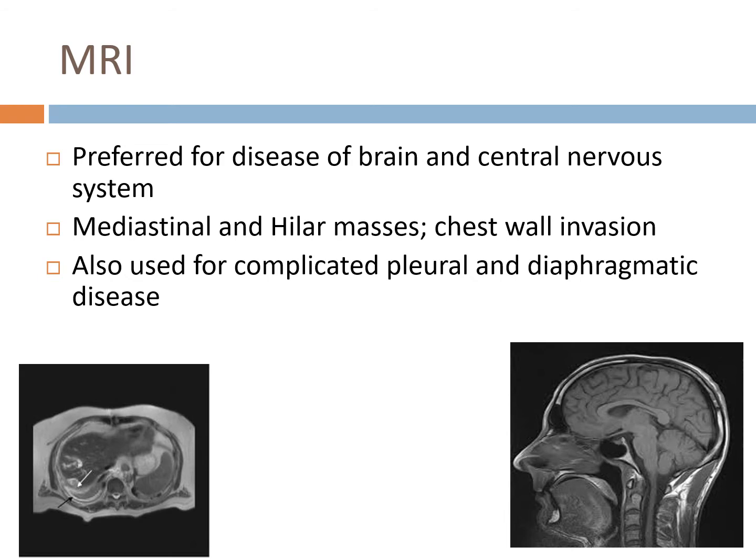It's really super loud when they turn that machine on. Plus all the protocols that are involved, you have to make sure you don't have any metals on. Rings are okay, but if you're wearing a lab jacket, like I always do, it's best to take it off because I always have stuff in my pockets like scissors. Pagers, watches, phones, your stethoscope, though of course we don't really have pagers anymore.